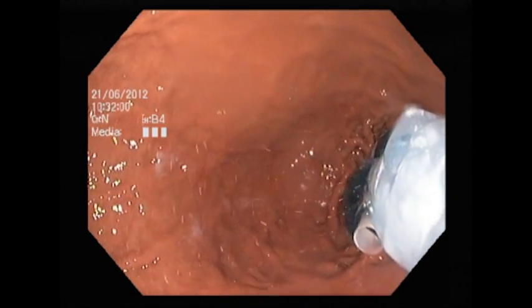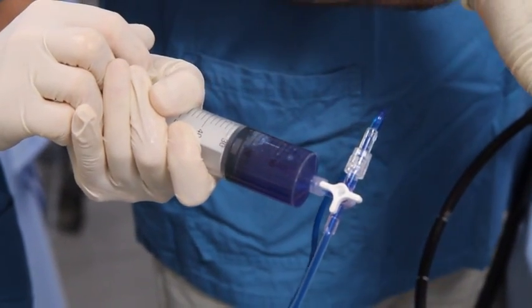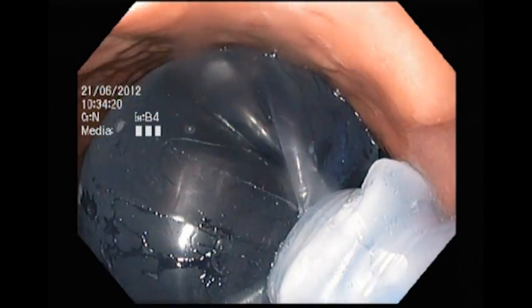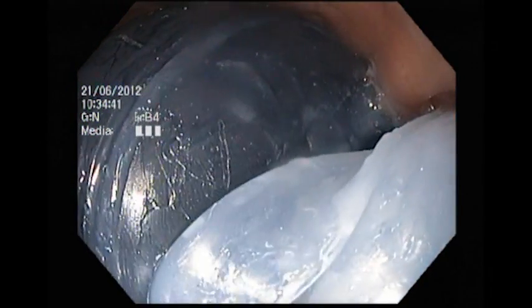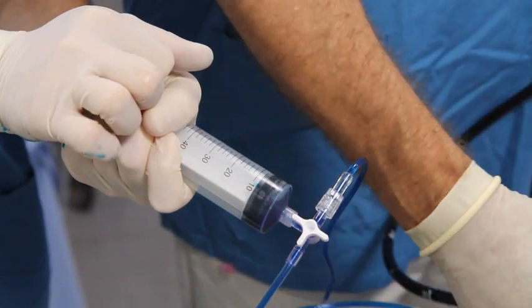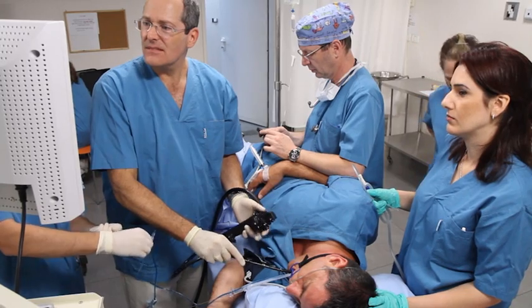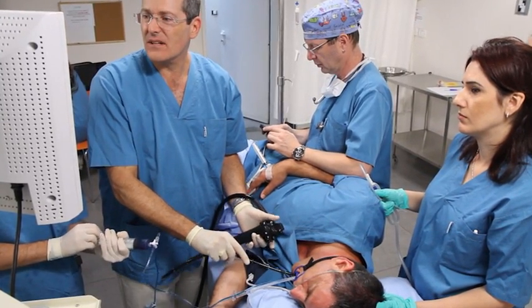Proceed to inflation. The balloon is inflated until all of the bands are pushed back on the catheter shaft. This will require about 500 cc's of saline. The completely filled balloon will have no creases and will have a thick cap. Once fully inflated, the balloon should be deflated to the desired final volume. We recommend 400 to 500 cc's as a starting point since it can be adjusted upward at a later date.